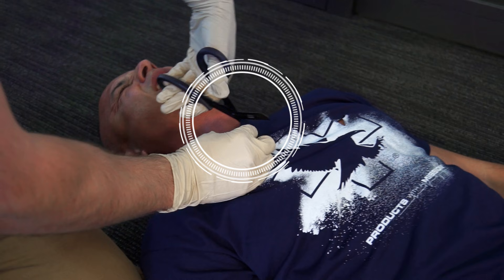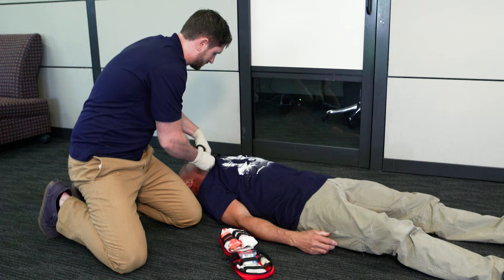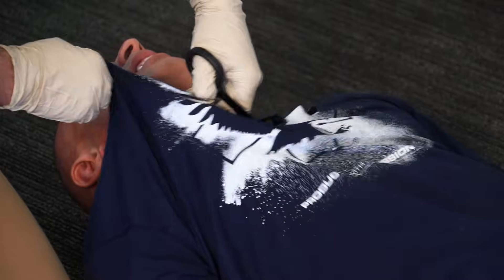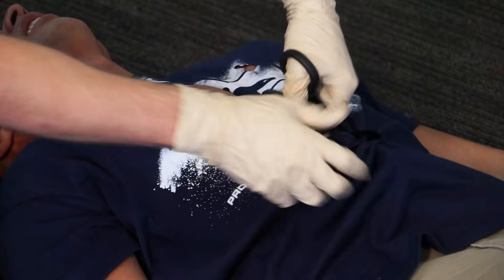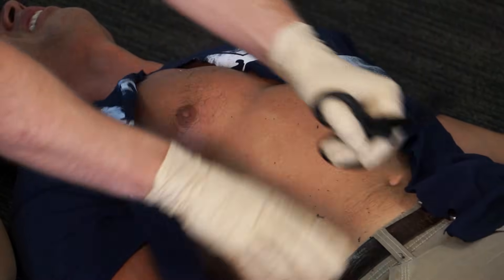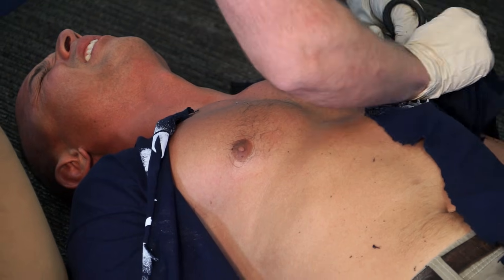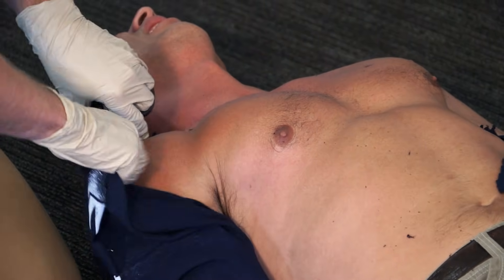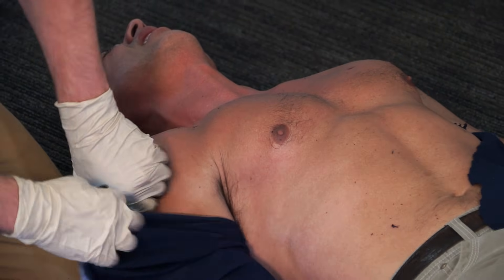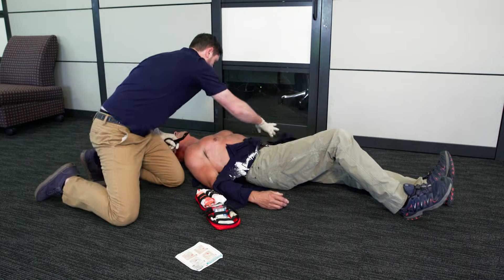Position the jaws of the shears at the cuff or edge of the clothing to be cut. While applying tension with the non-shear holding hand, cut the clothing by advancing the trauma shears with a cutting motion. Trauma shears are designed to rapidly expose a patient with minimal movement, so the rescuer may locate and treat wounds. Be sure to cut all the material away from the chest to expose any additional wounds. Move the cut material out of the way.